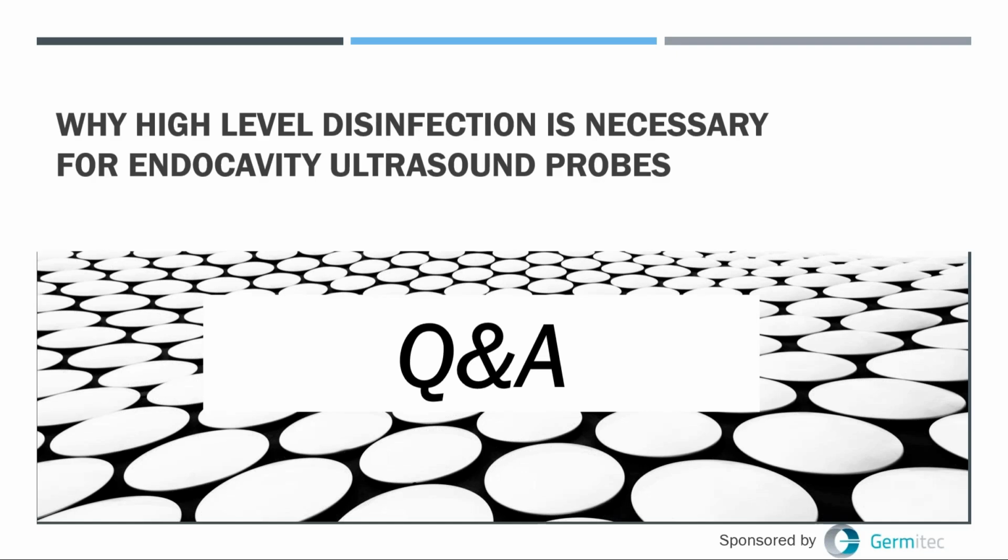Next question, do you have thoughts on the use of wipes for HLD? So the concerns about wipes for HLD, as opposed to another method such as UVC, are a number. I've already talked about the fact of redundancy. Here I'll also mention that to the extent possible in medicine, we've always found re-engineering a system is better than trying to educate individuals on how to do something properly.